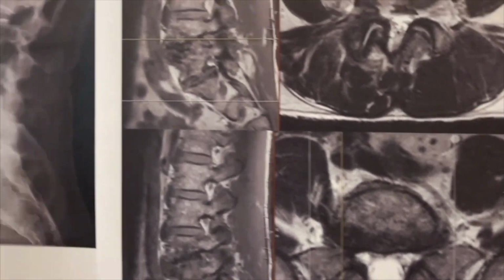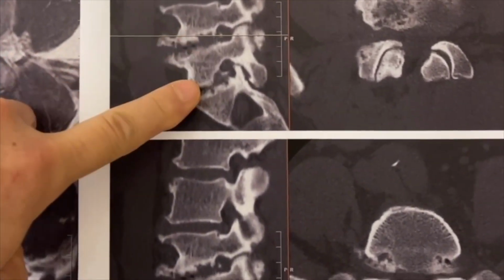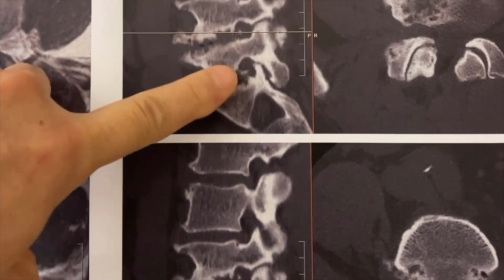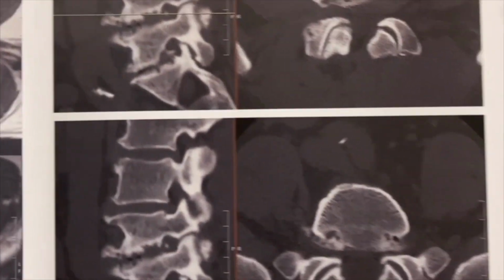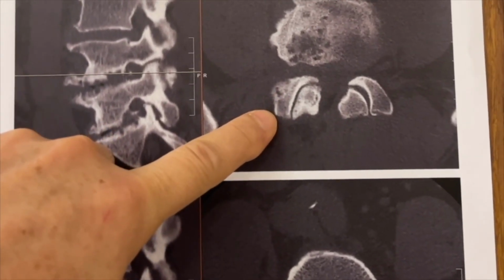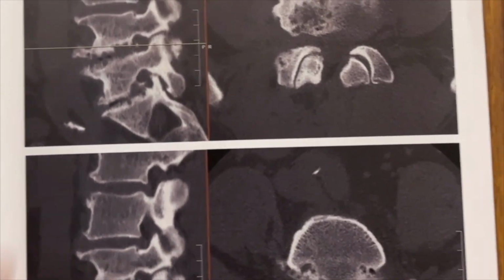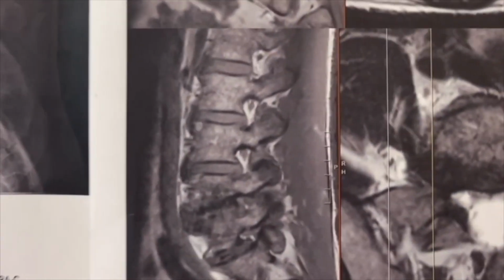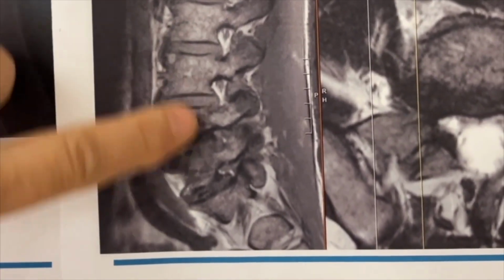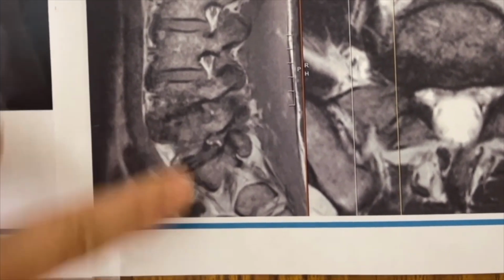He's had previous surgery. And if you look carefully, he's got incredible degenerative disc disease, but most importantly, right L4-5, L5-S1 neuroforaminal stenosis. Huge overgrown bone spurs on the lateral aspect of the facet joints, as well as bone spurs at the edge of the disc space. And compared to the levels above, that's the side opening called the neuroforamen. Look at the L4 nerve root on the right and the L5 nerve root on the right.